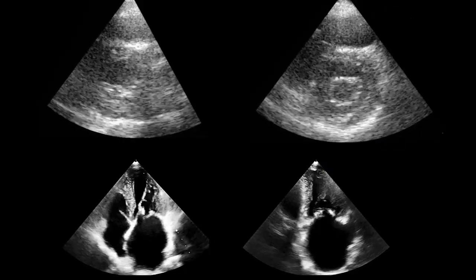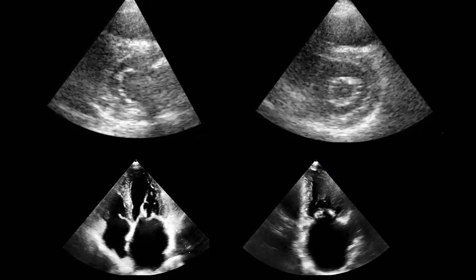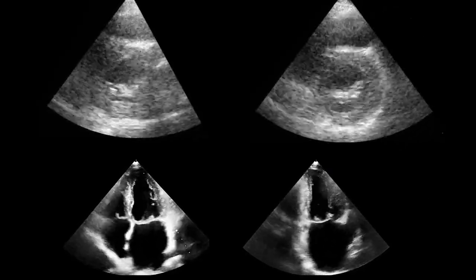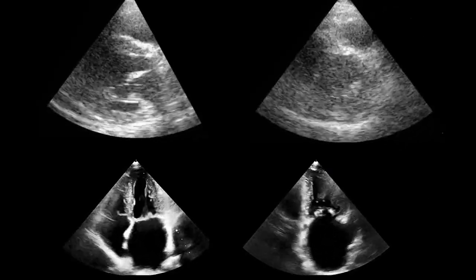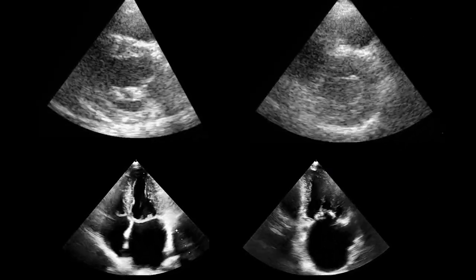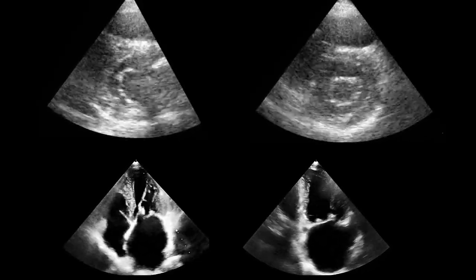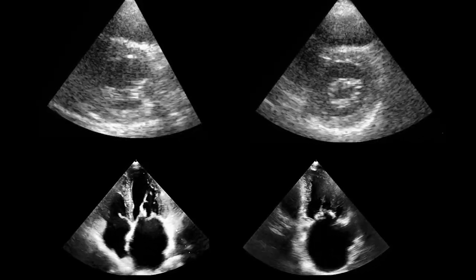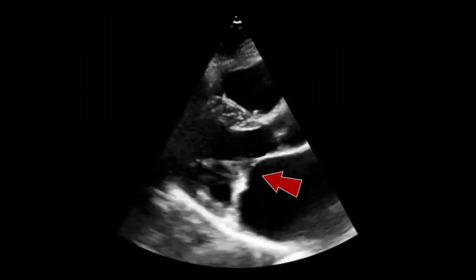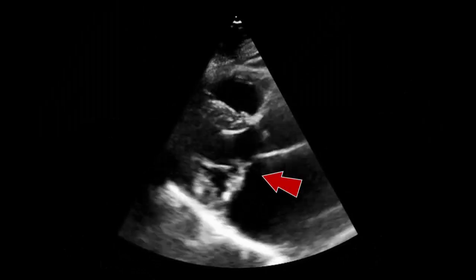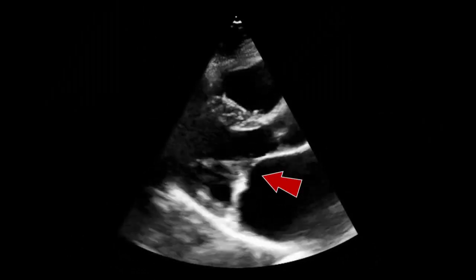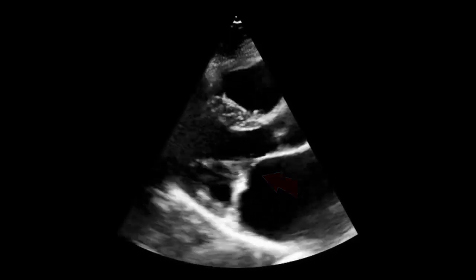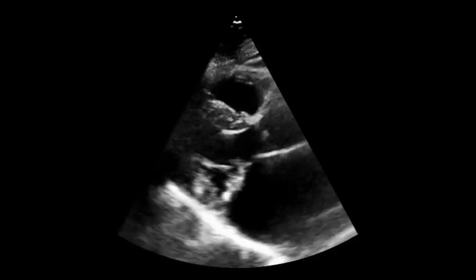With 2D transthoracic echocardiography we can evaluate the morphology of the valve, leaflet edges, fusion of the commissures, and calcific deposits. Furthermore, we can evaluate the presence of specific signs, such as the diastolic doming of the anterior mitral leaflet.